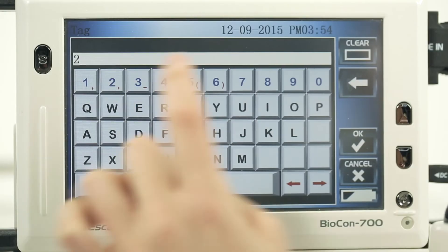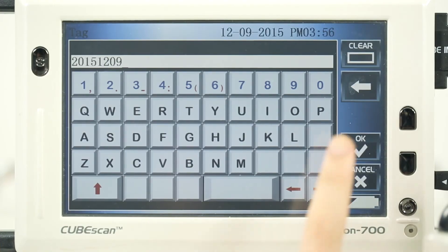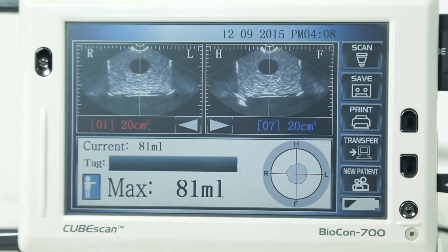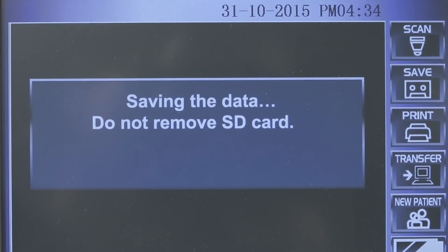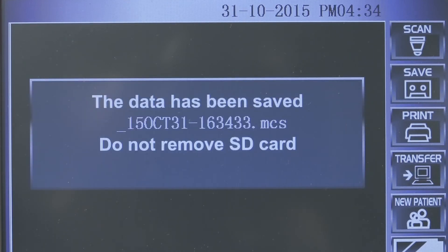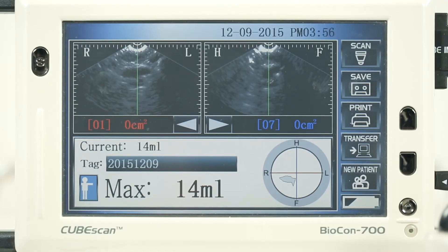Touch the ID tag as shown in the images. When finished entering the ID, press the OK icon. Touch the save or print icon to save or print out the result. There are record, play, and OK icons. The measurement will be completed after saving the data.